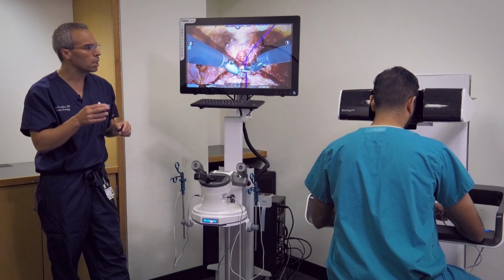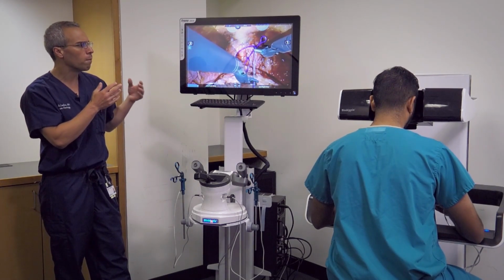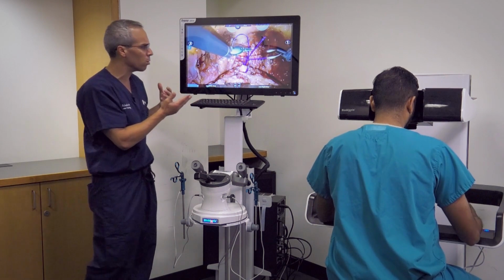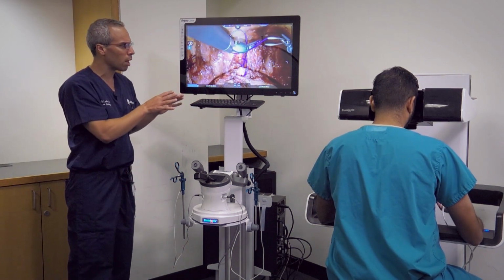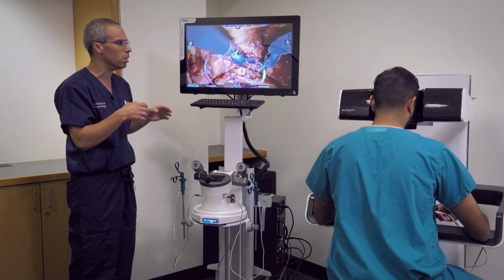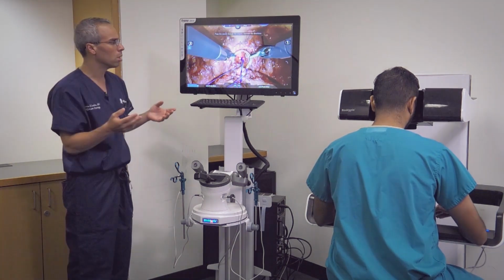So not only basic tissue identification, but also how to handle a needle in tissue. And I think that's where this is extremely valuable, because if you watch Hummer actually do this portion of the operation, he's following the needle all the way through the tissue. And that is something that we try to teach our trainees when they throw sutures.